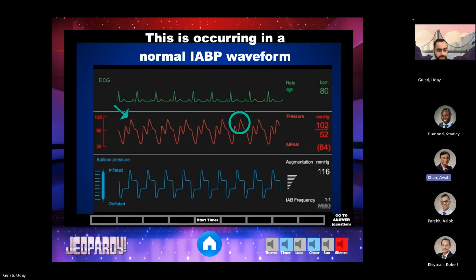So what's in that patient that's not in the normal patient? Meaning the pump. Like the pump. Right. So is the waveform measuring something that's happening to the pump? Right? How would an arterial line look like in a normal patient compared to how it looks like now? This is occurring in the normal. So what does an A-line look like? He's saying that there's an extra hump in the balloon pump waveform compared to an arterial line waveform. Okay. So what does that extra hump indicate?